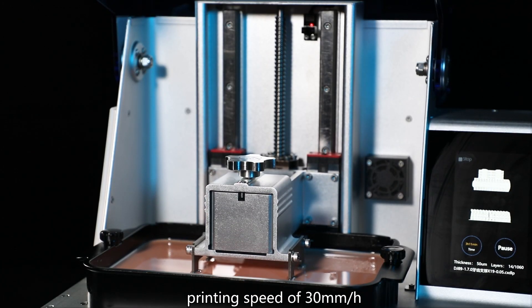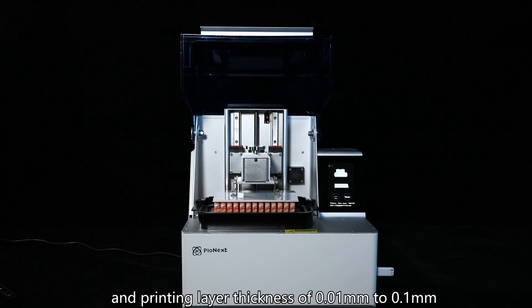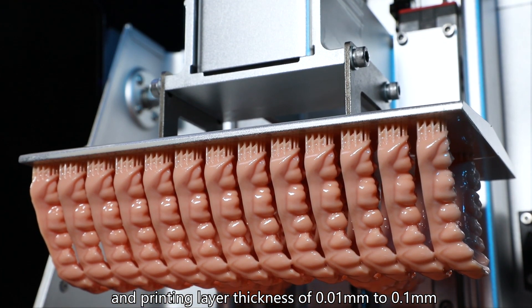Print speed of 30 mm per hour, and print layer thickness of 0.01 mm to 0.1 mm.